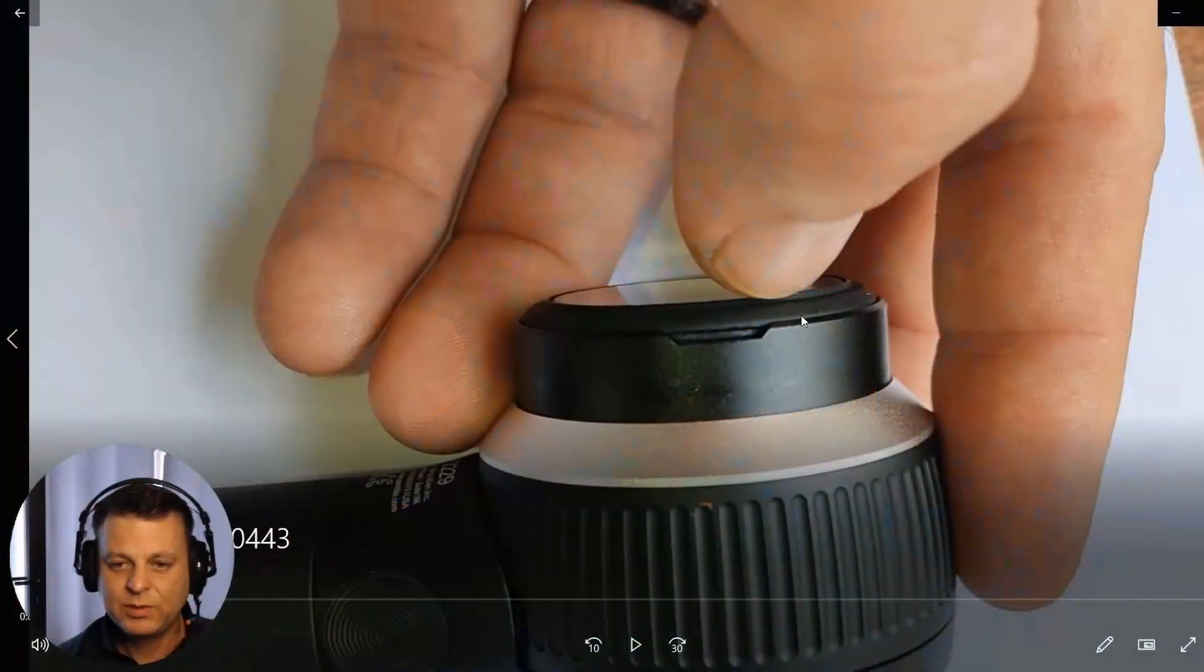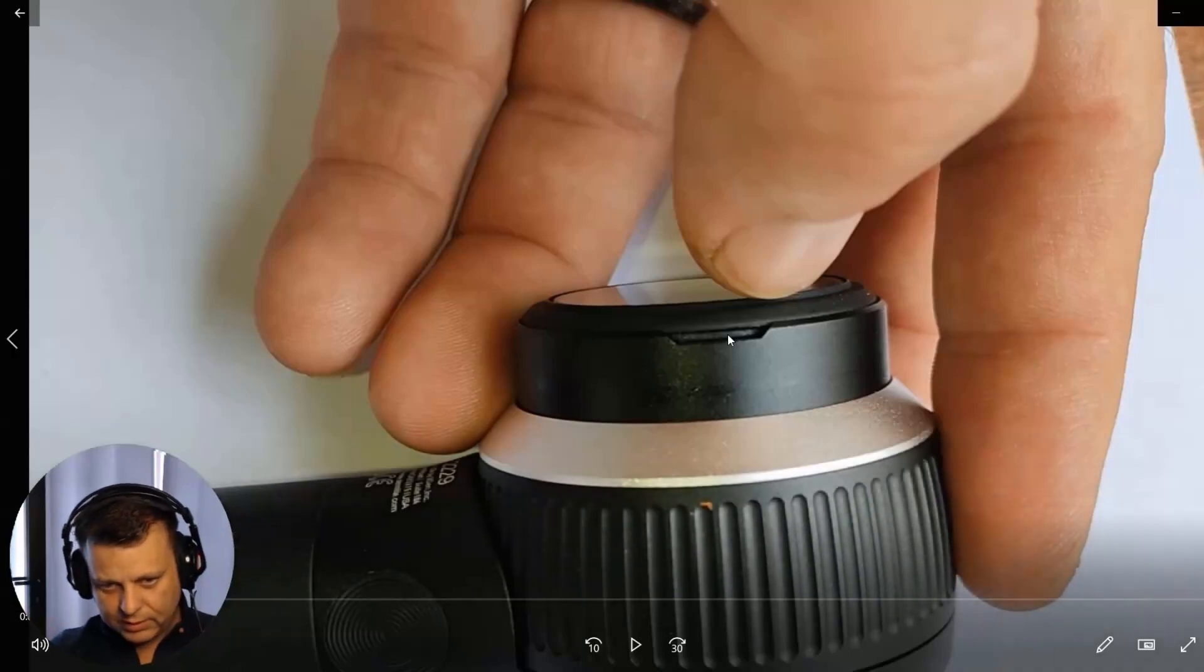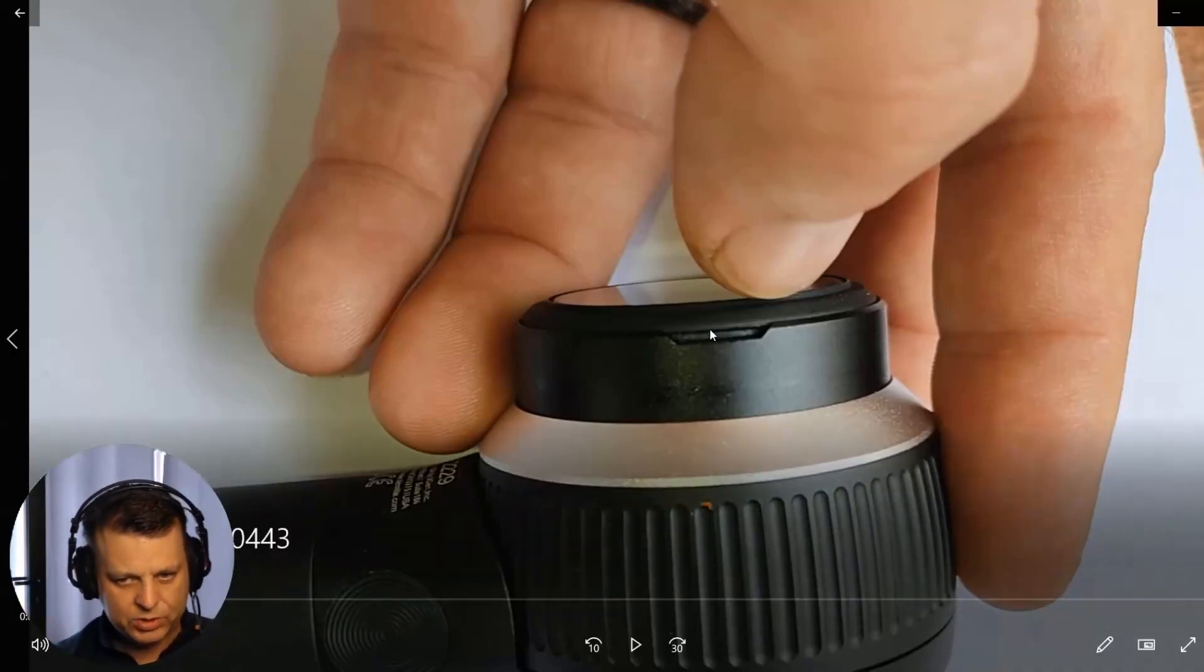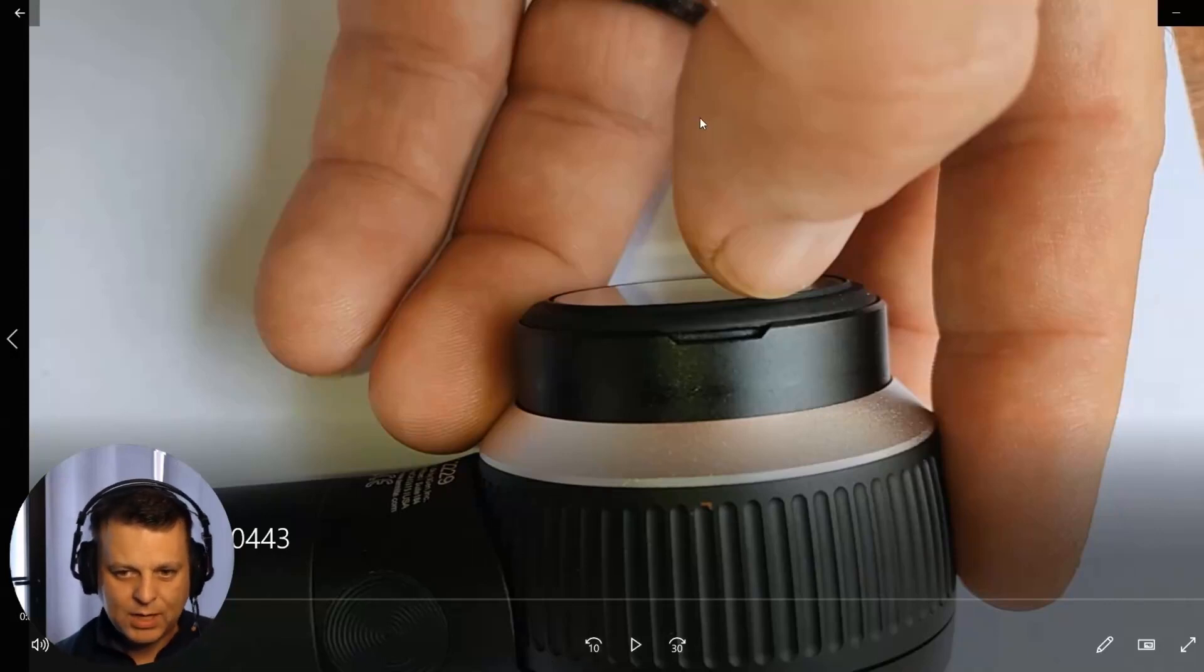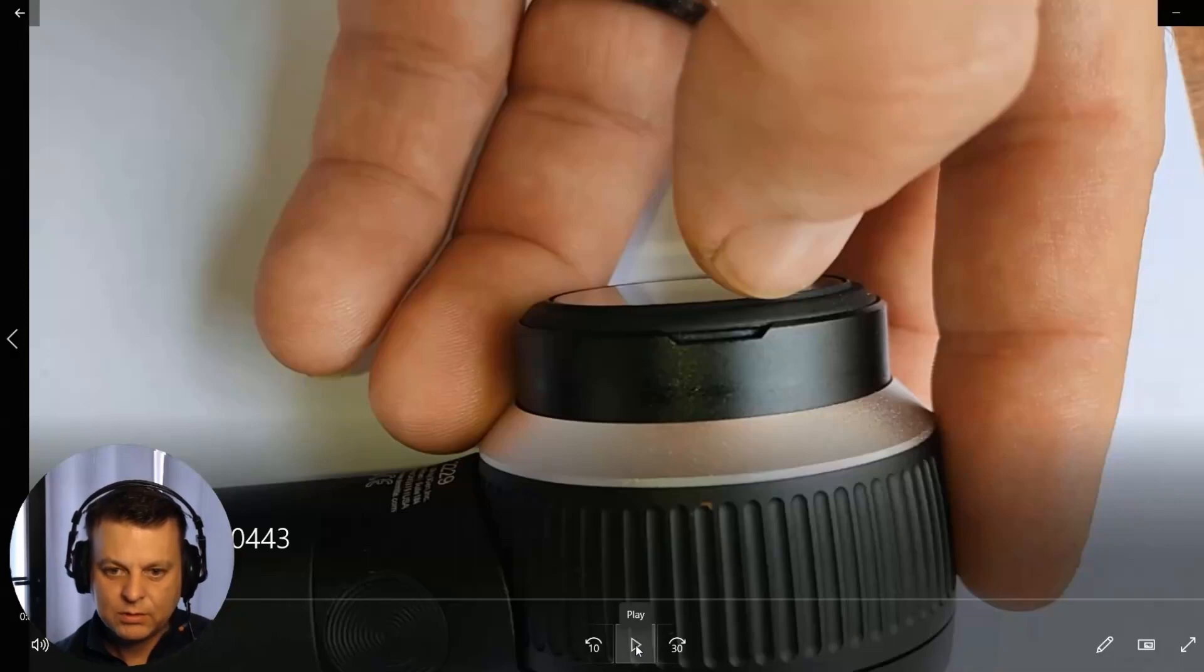This is the faceplate itself, and this little indentation is where you could reach your fingernail in or take a screwdriver, but honestly, I would just use your fingernail. Press into here, and you can pop out the older faceplate that's cracked. Let me show you here.